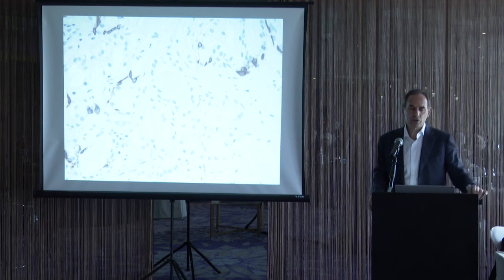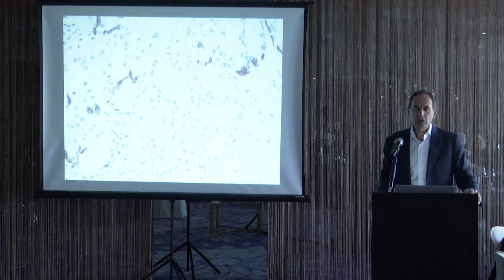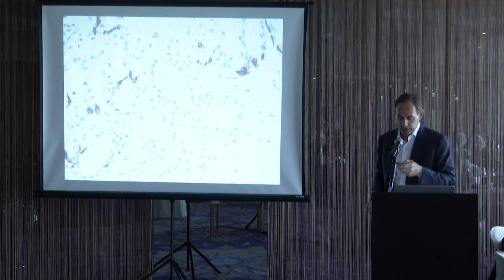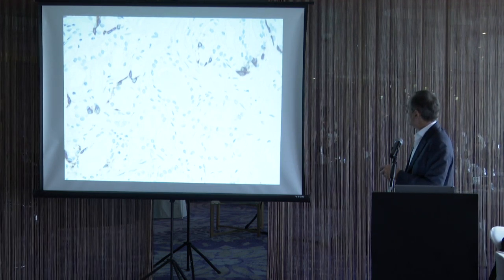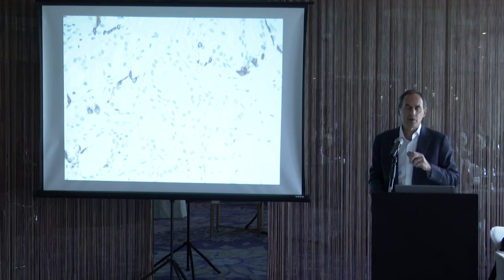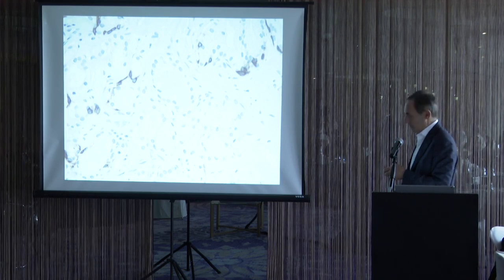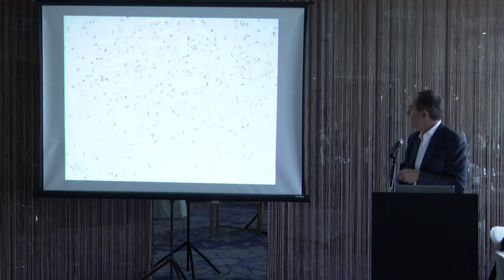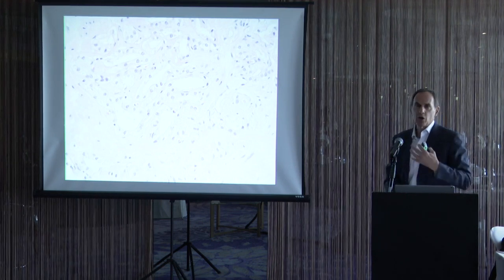The problem with partial atrophy is with the basal cell stains and racemase. So in partial atrophy, you can see typically just very patchy staining. First of all, many glands will be entirely negative, and the ones that are positive often just have a few cells that are patchy positive. But what you have to do when you look at a case of partial atrophy is to say, are the glands that are negative, do they look identical on the H&E to the glands that are patchy and positive? If the entire lesion looks the same, and some glands are patchy and some are negative, then it's all benign.